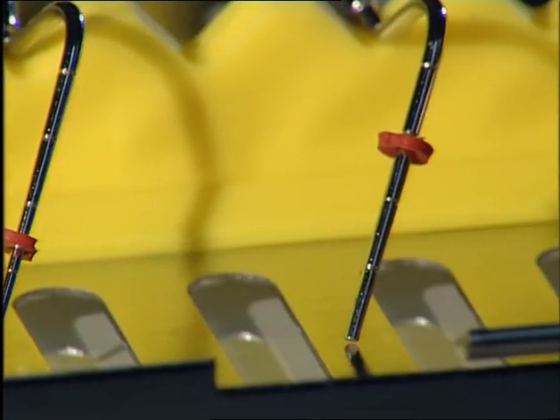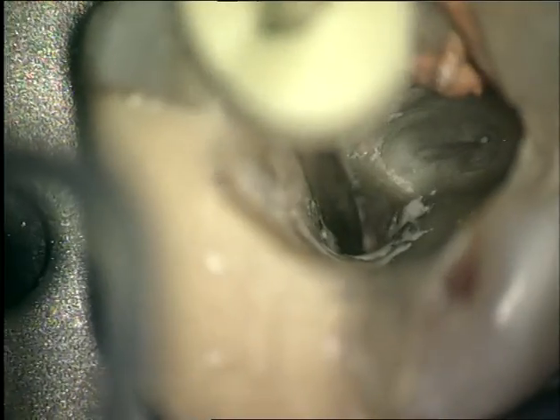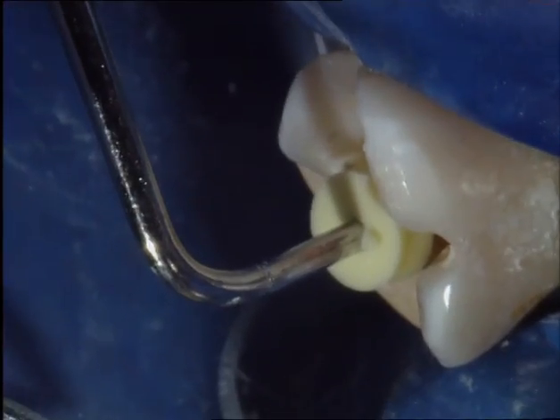It soon becomes appropriate to select the next smaller plugger as the narrower portion of the canal is approached, so that the plugger never meets resistance on unyielding dentinal walls. Depending on the canal length and size, the same plugger may be used several times. Following the latest heating and gutta-percha removal cycle, a sustained vertical press on the plugger for 10 seconds will produce the final wave of condensation. This will effectively offset any shrinkage that may occur during the gutta-percha cooling cycle.